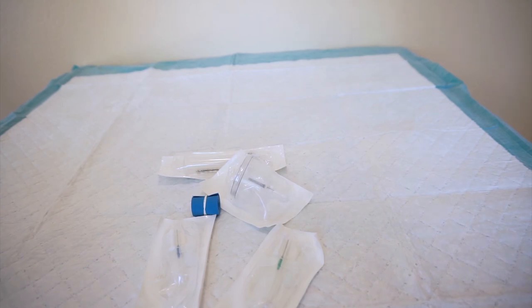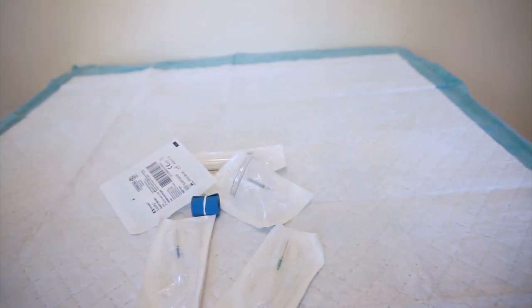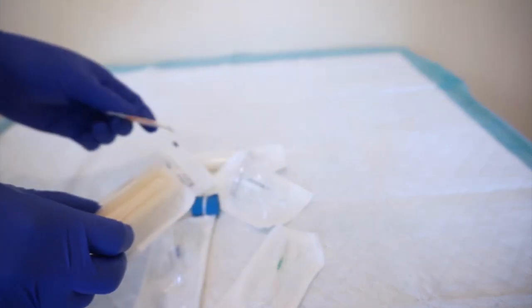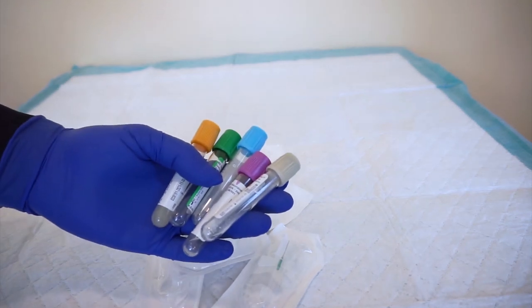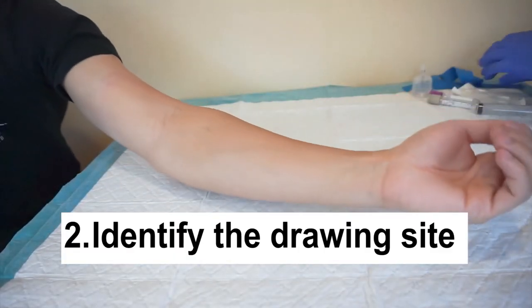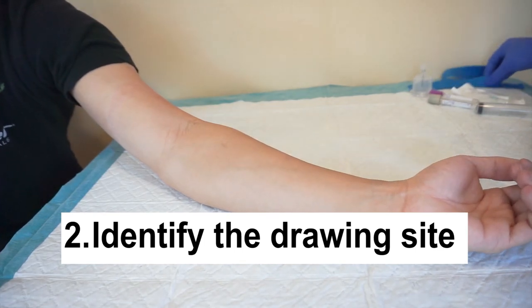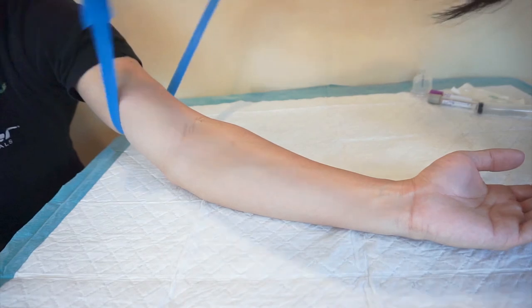If you have small hands and handling a big syringe will be difficult for you, you can choose to connect the syringe with the butterfly needle and change multiple syringes with one butterfly needle. Be careful as you are changing the syringe not to pull out the needle. Tape the butterfly tube down if you need to. Second, identify the drawing site by palpating patient veins. A good bouncing vein is not always visible by the eyes.